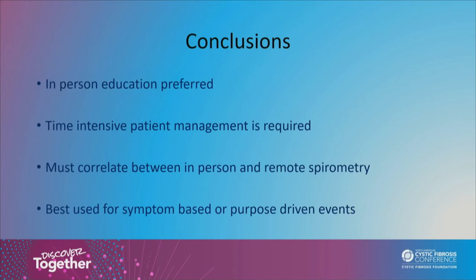So I think the conclusions that I drew when I went back and looked at all this is that we had the best success with in-person education, helping them download the app, helping them sync the spirometer, putting their demographic information in for them with data that we had from their clinic visit. That provided the best results. These are time-intensive projects, and there's a lot of management of the patients, the dashboard, and troubleshooting, so you're going to spend some time doing it.